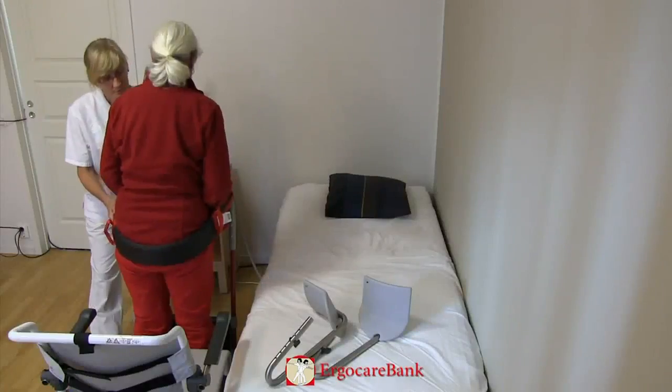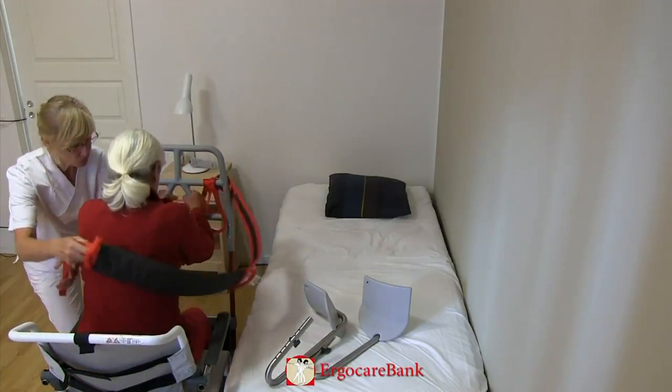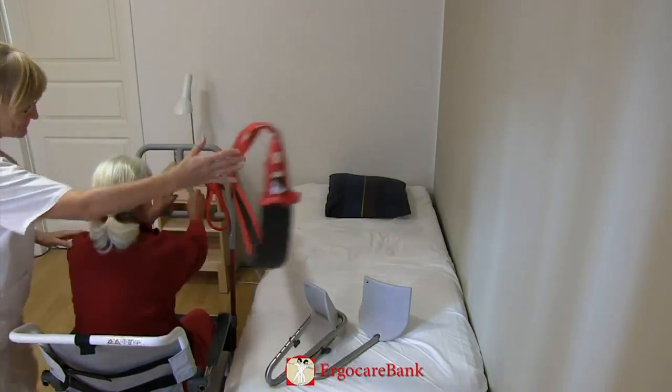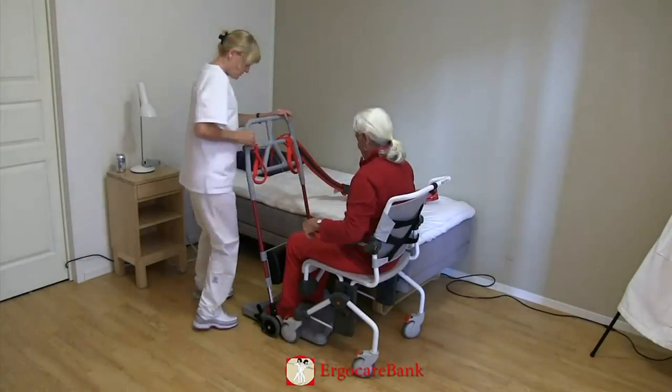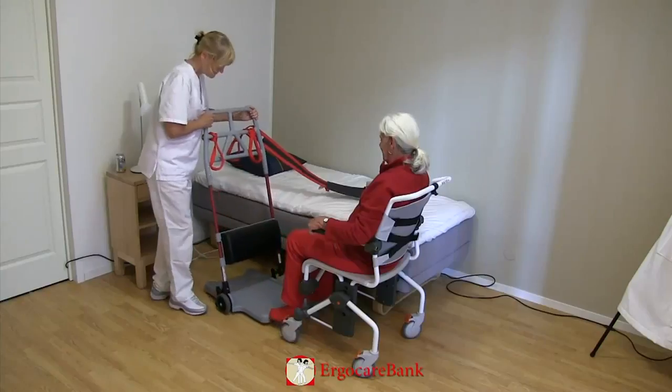The staff member unhooks the belt from the Raizer, and on one, two, three, Celia is slowly lowered into the shower chair and the belt is removed. The Raizer is removed.